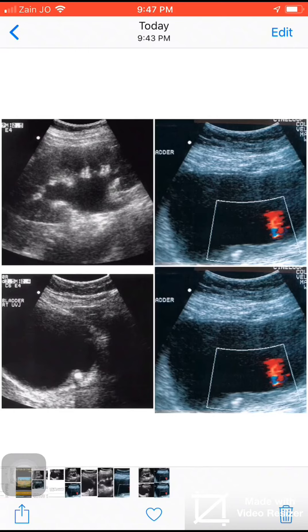With Doppler ultrasound, there is a ureteral jet on the left side, but there is no jet on the right side, as we see in this Doppler ultrasound. This means there is complete obstruction on the right side.